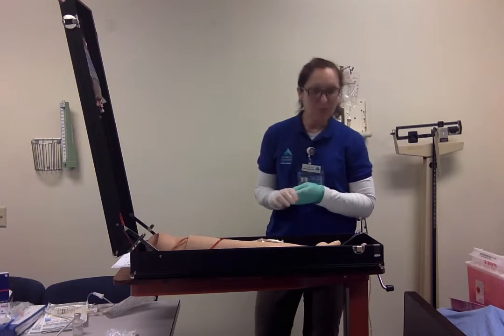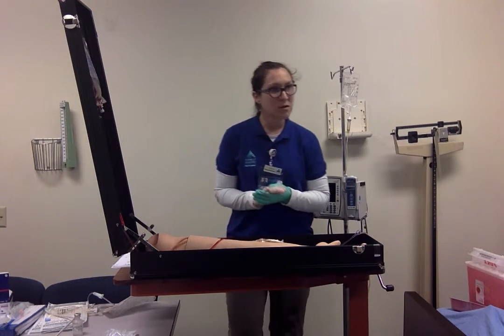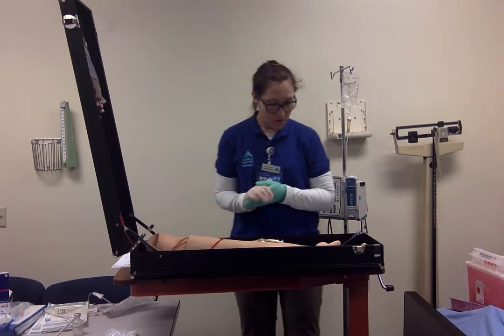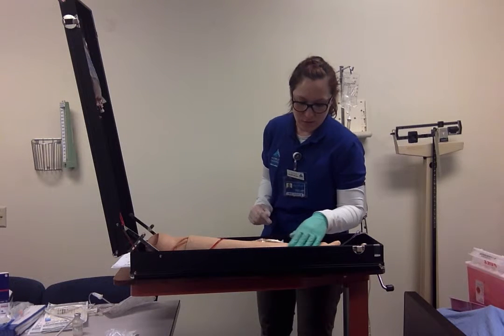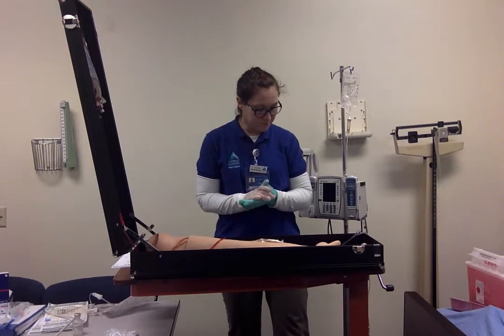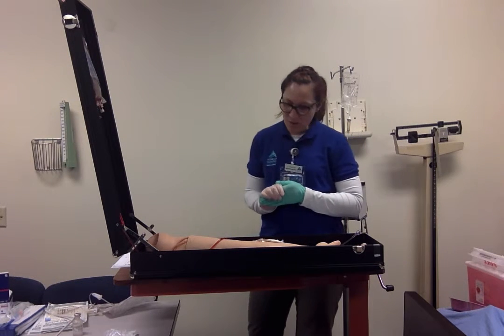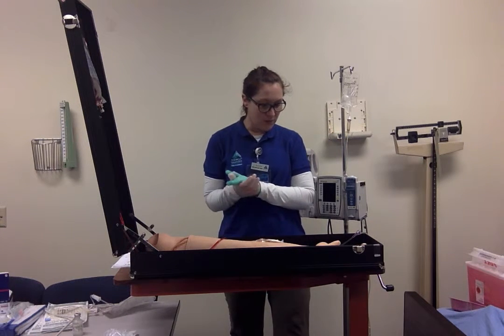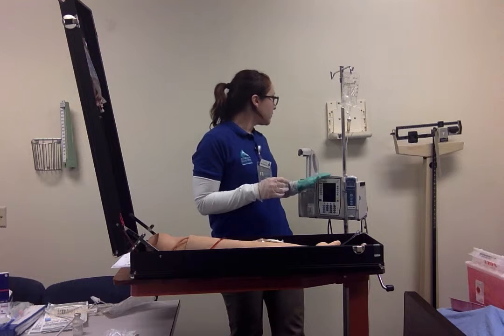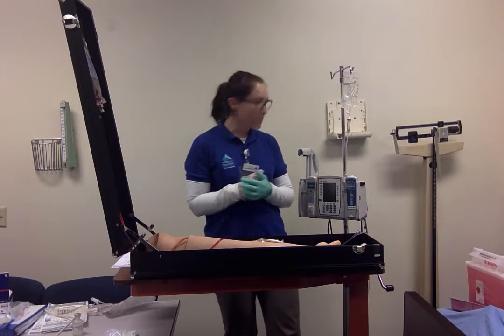So everything looks good. I still don't have any infiltration or phlebitis. Everything looks good. If I had an alligator clamp, I would apply that, but we do not have one, so I won't be doing that. I've already reestablished the flow rate to make sure that the primary is back to where it's supposed to be.